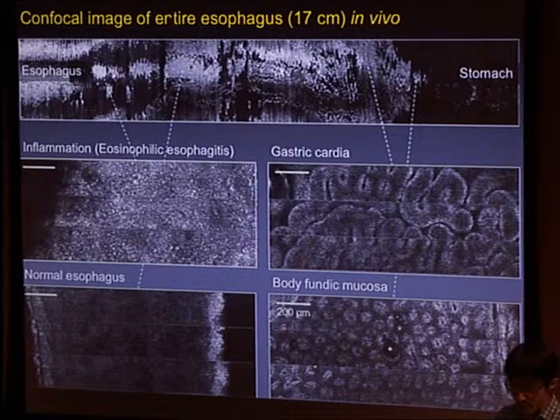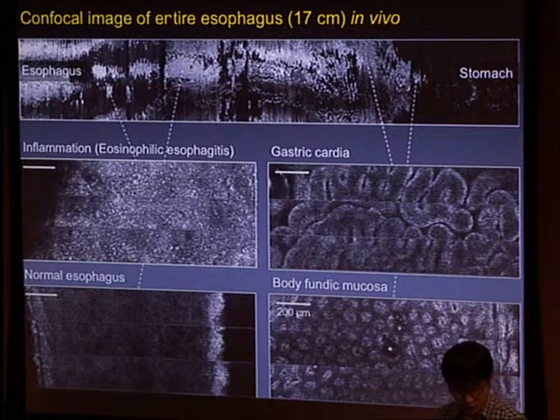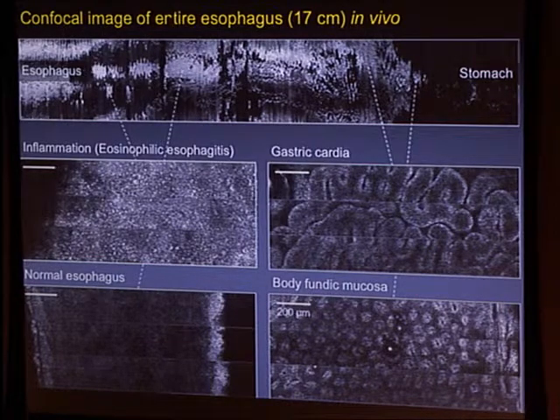So these are the sorts of things that we can do with this comprehensive approach. When you spin this thing and you withdraw it, what you're actually recording is the spectrum as you rotate. Right. And then afterwards you're reconstructing from that spectrum. Right. That's correct.